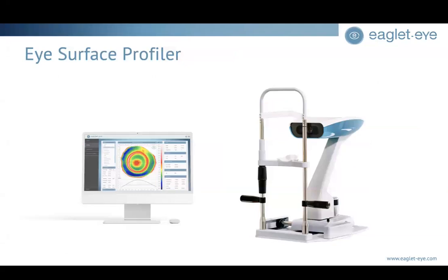Now, our eye surface profiler, let's get started and dig in a little bit here. I want to explain first a little bit about how the technology works. The unit's here on the right-hand side. Left is a screen that you'd commonly see with the software on it. We're going to dive in just a little bit closer to take a peek first and explain the technology behind the ESP.